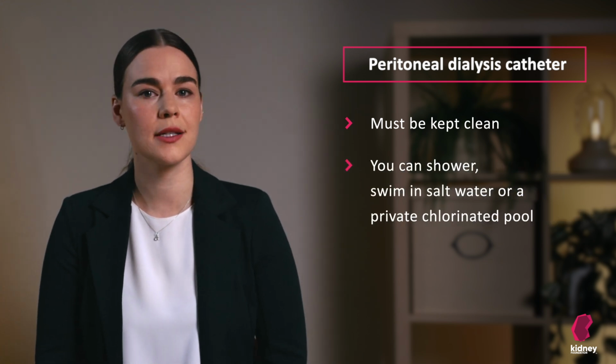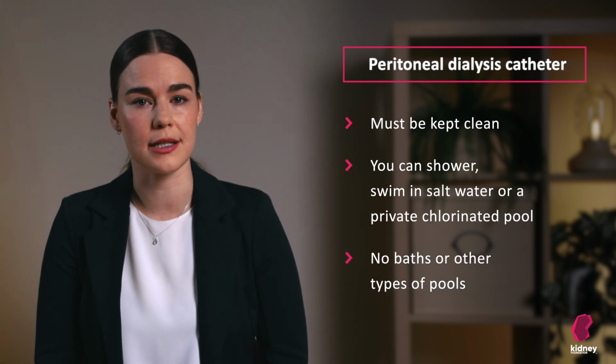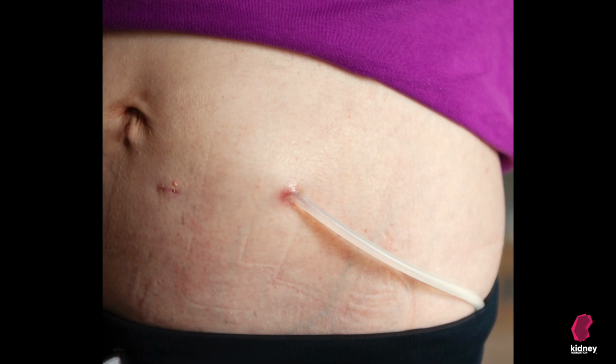You can shower and swim in salt water like the ocean, but you cannot take a bath or go in a pool with this catheter unless it is a private chlorinated pool. Here's a picture of the catheter.